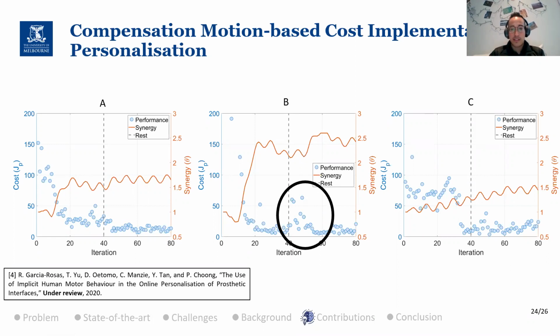I assumed that this person sort of forgot what they were doing, and we saw that jump in the cost, and the person is relearning, like, oh yeah, I was doing this, and it goes down again to what it was before. This obviously affected the performance of the algorithm because we would be expecting a specific gradient, but then that discontinuity, that big jump, caused trouble there.